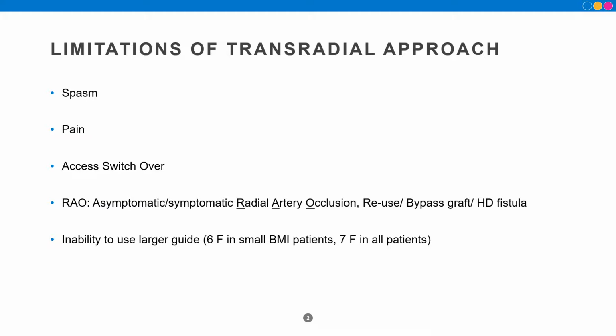But in 2019, my patients still suffer from spasm, pain, and at times require access switchover for the same. I have seen my patients suffer pain when inserting or removing the sheath, at times because of a tortuous artery, or at times after performing diagnostic coronary angiography while advancing the guide catheter, patients suffer spasm.